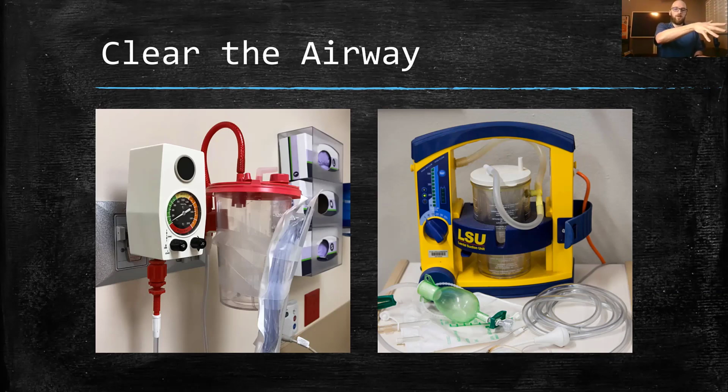So let's do just a log roll, get that person onto their side first while somebody else is getting our suction set up. That's a very good typical style test question that highlights the point that I made at the start, which is we work our way from least invasive to most invasive. Rolling somebody on their side is less invasive than shoving that suction catheter further back in their mouth. So roll the person on their side, let gravity help drain whatever fluid is out while you get your suction ready to go.